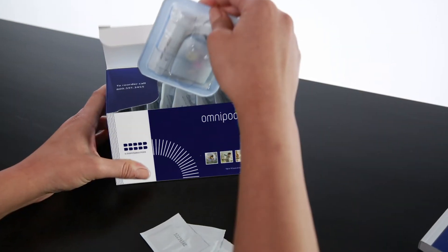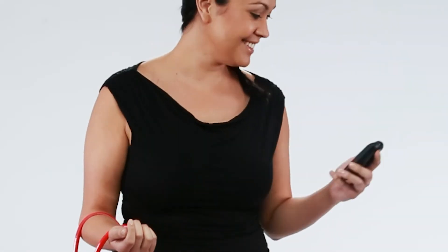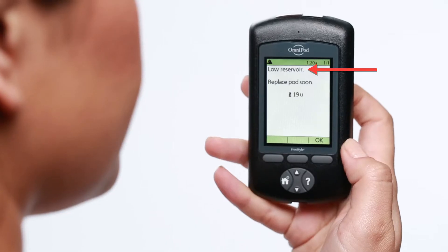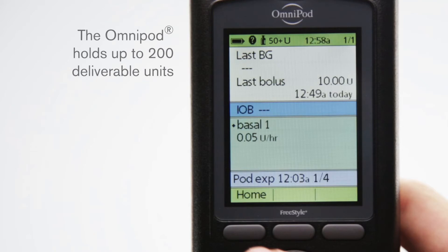You may need to change the Omnipod for the following reasons: a low or empty reservoir. Your pod will alert you when you have a low reservoir and suggest a pod change soon. You can view the amount of remaining units at any time by checking the insulin gauge at the top of the status screen. When your reservoir contains less than 50 units of insulin, the icon changes to indicate the exact amount of insulin remaining.